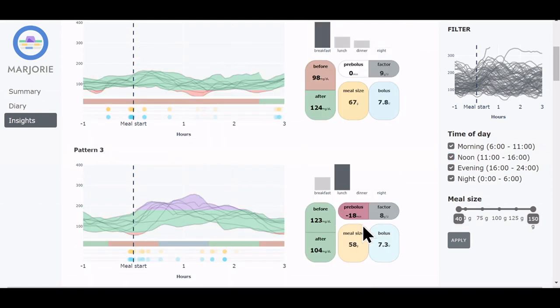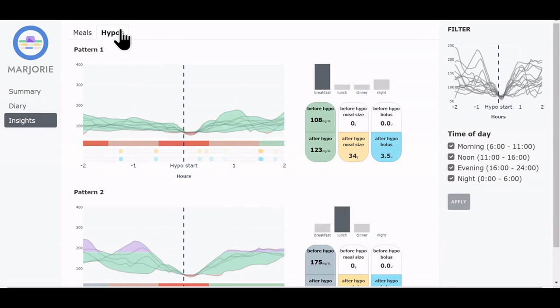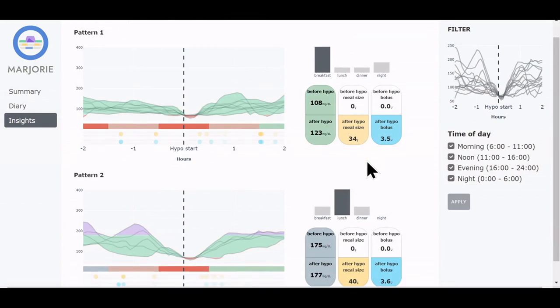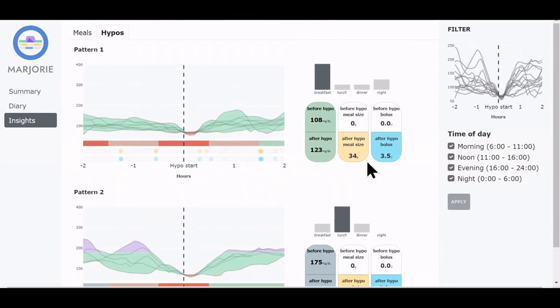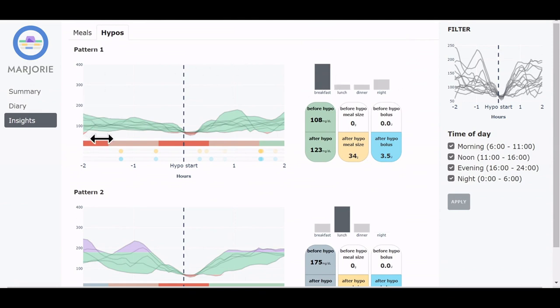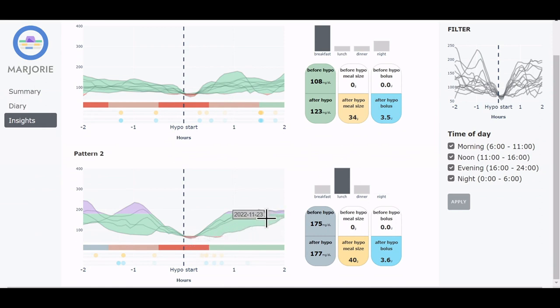We now navigate to the Hypos tab, which clusters typical glucose profiles around low blood sugar incidence. And we see that there are two main patterns. In the first, which occurred mainly during the morning, the glucose levels are mostly within the target range before and after the hypoglycemia. And in the second, the glucose levels sink rapidly, enter hypoglycemia, and then return to high levels once more, probably due to binge eating of the patient.